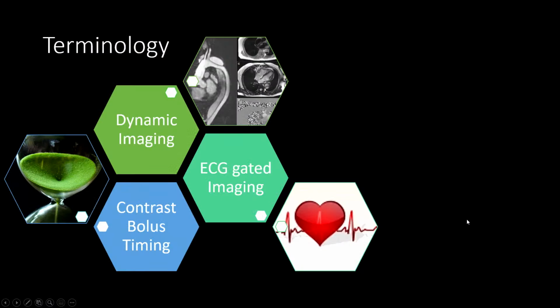We're going to go through some clarification of terminology, and I've learned this a lot by working with multiple specialties, surgery and cardiology. It's really important to make sure people understand what I say. We are going to talk about a lot of concepts, but I would like to urge you to see them in two different contexts. One is that, especially in a setting of aortic dissection, there is always going to be a lot of cardiac movement, so we are going to resolve our imaging by EKG phasing. That's one way to look at it, EKG gating.